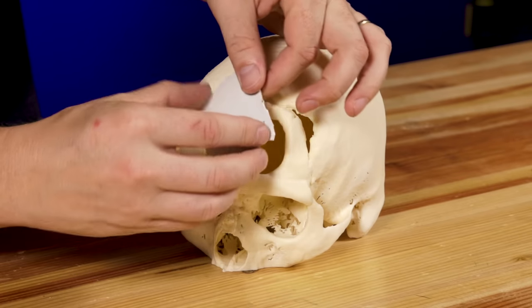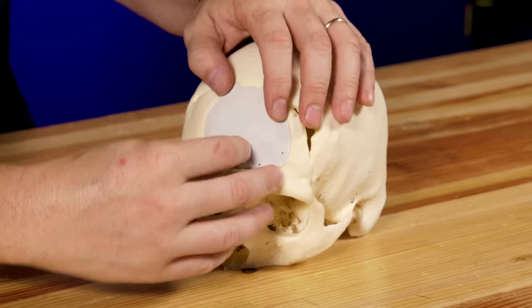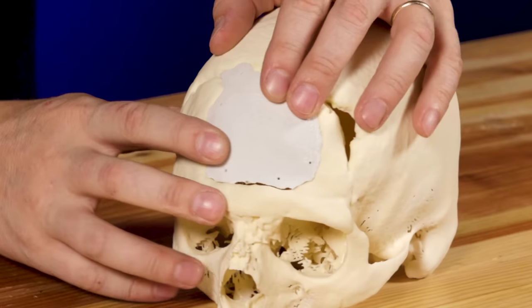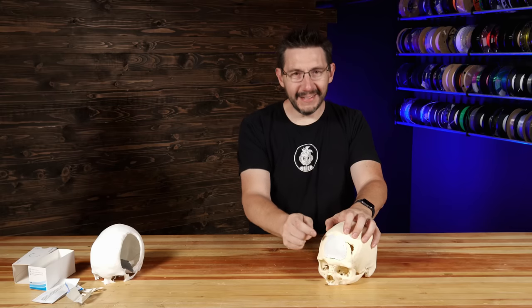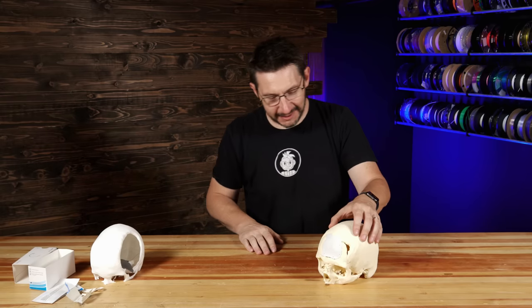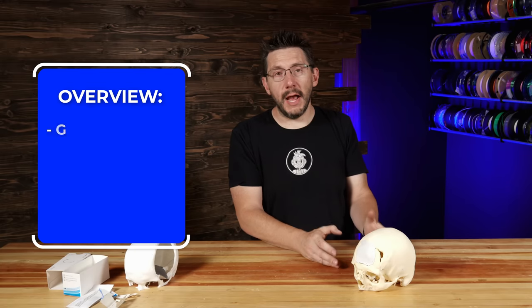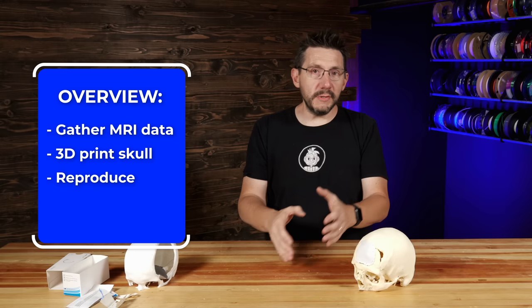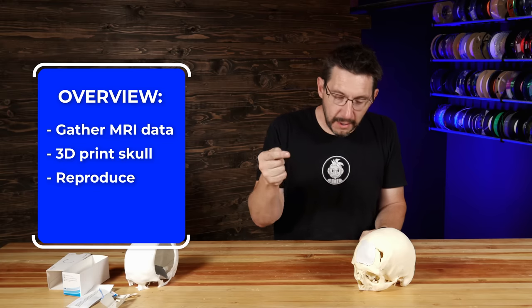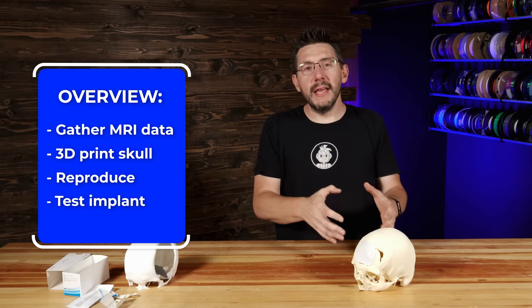Let's just find the right way for it to kind of... just keep twisting... yes! Look at that — it's a perfect fit. So when you take the data from an MRI, you can 3D print the skull and then accurately reproduce it in meat space, where you can then test the implant before it goes into the human body, so the doctors aren't surprised during surgery.